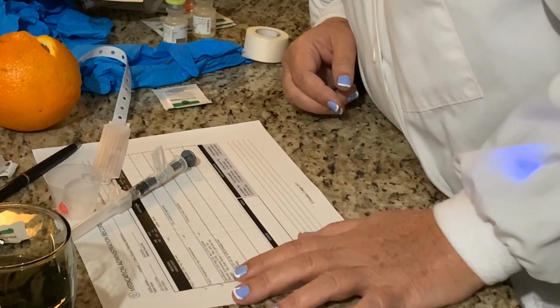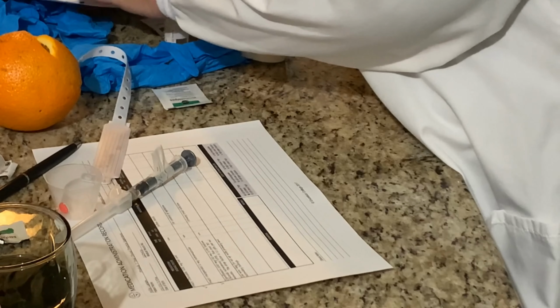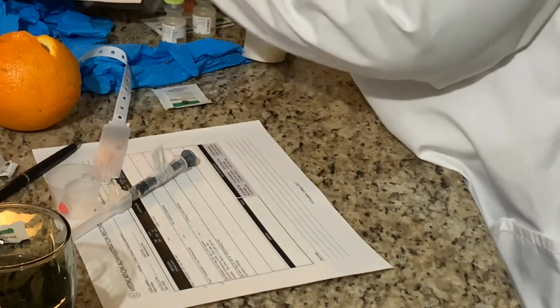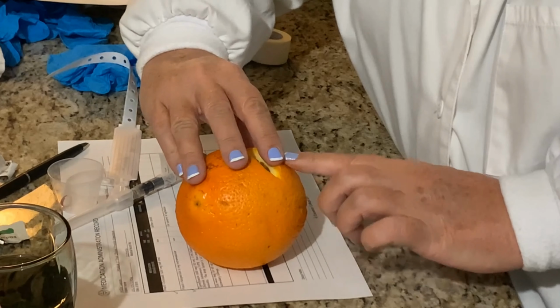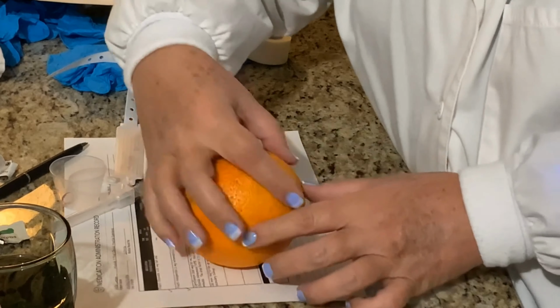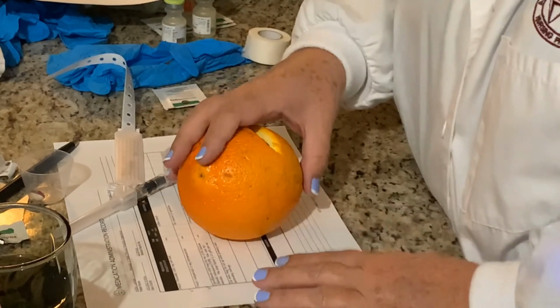And I've checked my meds 3 times. I've also had 2 forms of identification. I've explained the procedure to the patient. And so when I give my landmark, I'm using a piece of fruit here, but on the deltoid, I would do 2 to 3 finger breadths down from the shoulder. And once I'm at that site, that's how I know. And it's kind of like a pear shape. So you kind of want to show that either on yourself or your piece of fruit on the video so that I know that you're aware of the landmark.